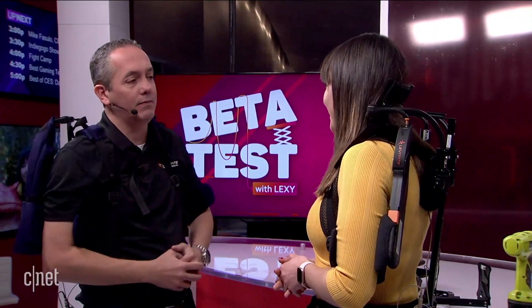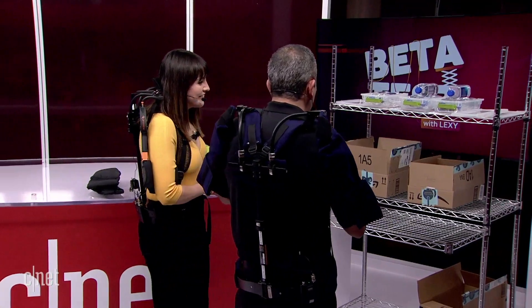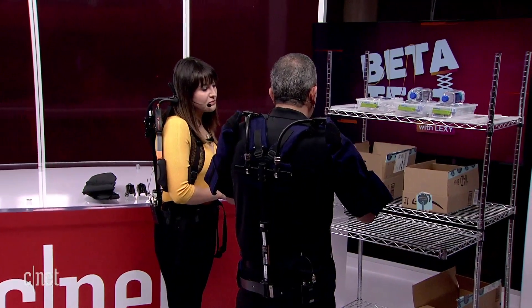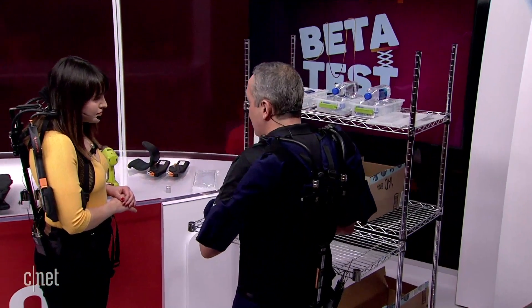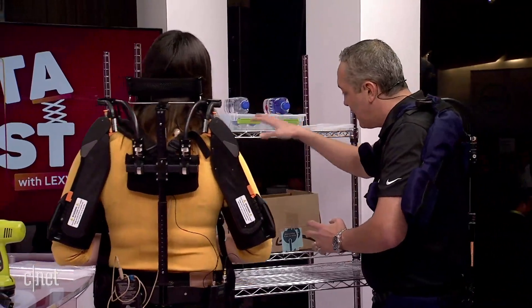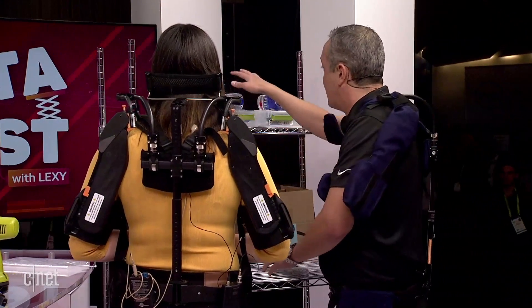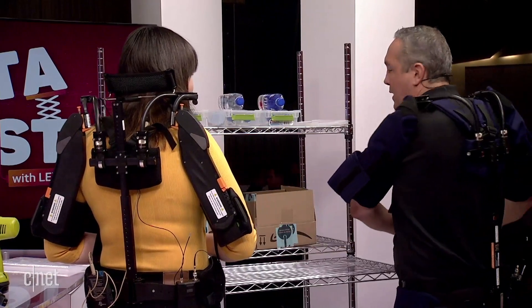One of the latest entries into the exoskeleton world for us is picking and packing at fulfillment centers. We wanted to simulate a picking and packing environment that people do all day long at places like Amazon or Walgreens. We want you to do exactly what they do: put the bottles in here — you can imagine this being any type of merchandise — close the box as if you taped it, and push it to the conveyor belt. We'd like to do the cycle once without the exoskeleton activated first.